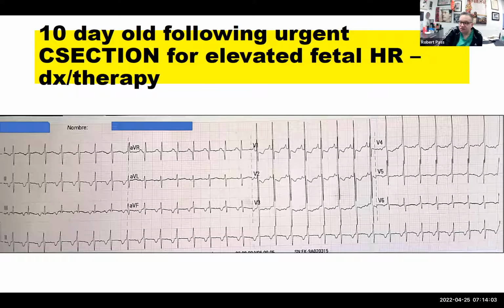In this case, the other thing I would say is that you were absolutely right, Sergey, that normally if this were EAT, we would expect that the primary atrial arrhythmia would persist and there would be heart block transiently from the adenosine. But some EATs are adenosine sensitive, at least transiently. So it's a helpful maneuver, but it isn't necessarily going to give us the diagnosis. It's nice if it does block the AV node and the tachycardia persists, but sometimes adenosine will cause the EAT to terminate as well, at least transiently.